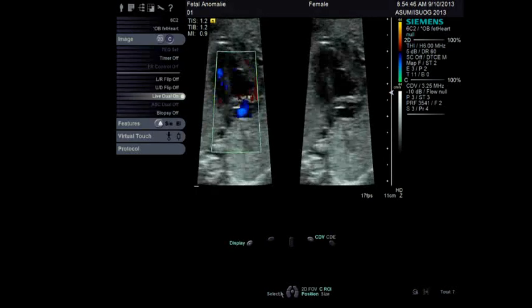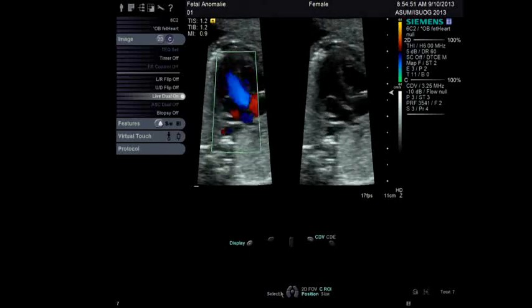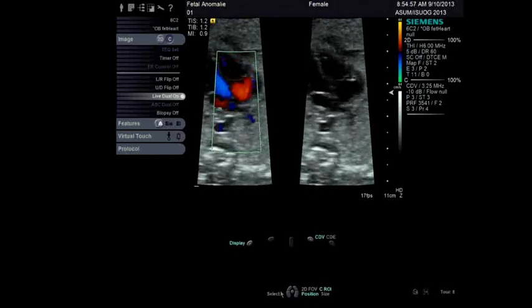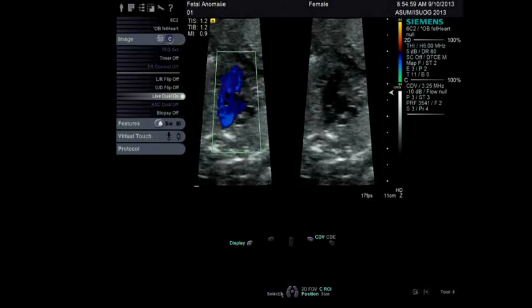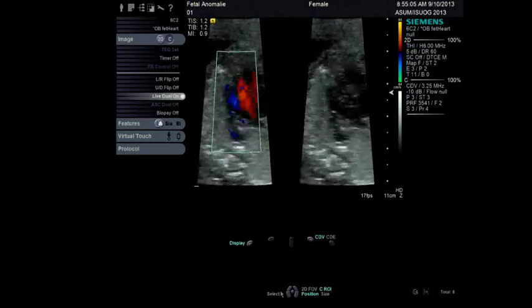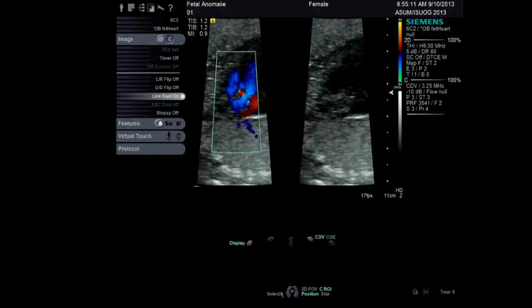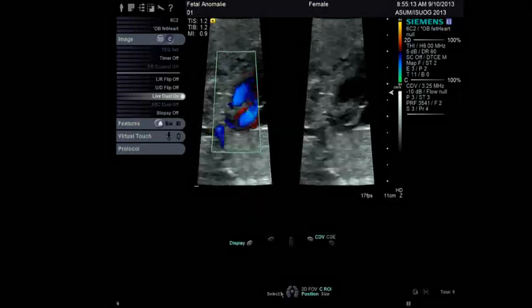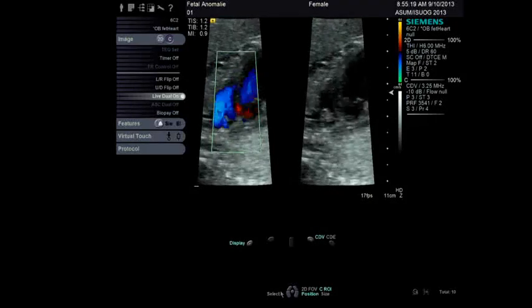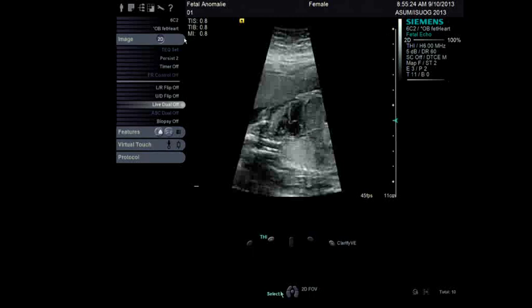Moving from the 4-chamber view, looking at the size and the shape of the heart, the orientation of the heart, moving upwards, very, very slight movements here to see the left and the right ventricular outflow tracts, and up to the 3-vessel view, tracheal view. And again, always good to get a sagittal view also. Just triangulate really the anatomy, not just by looking at one view, like the axial, but always try and get a second view as well of sagittal or coronal, depending on what you're examining.